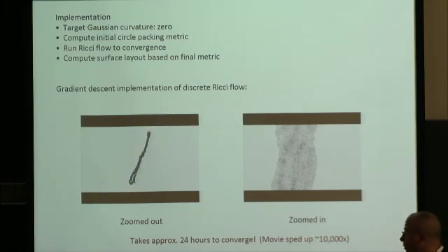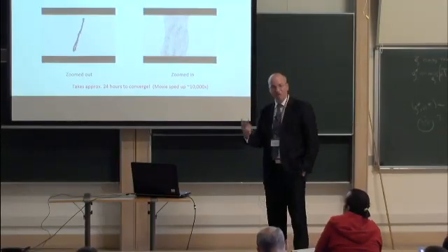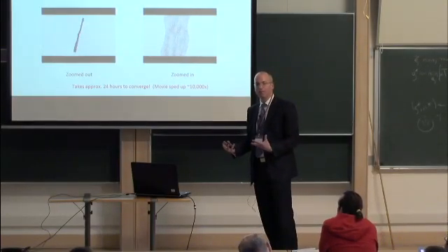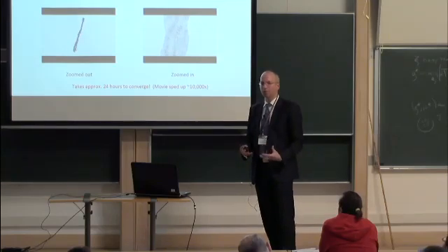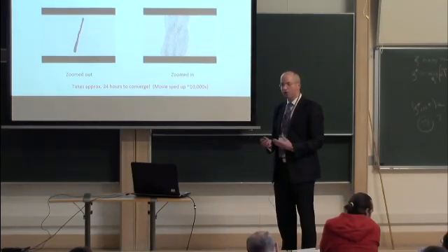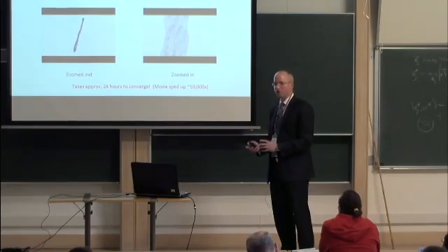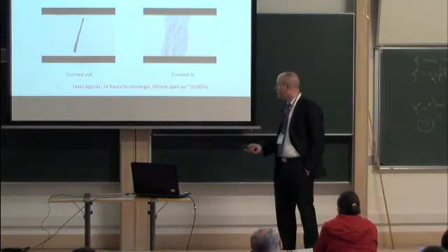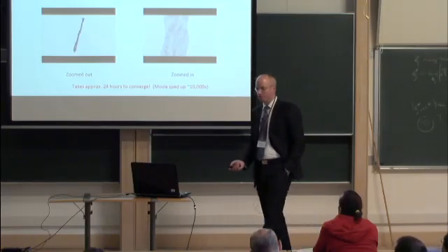So while this technique works very well, unfortunately it takes about 24 hours to converge for a single mesh, and we have 2 meshes. So this is a real problem for us because, working at a company, we want to make a very practical product that radiologists can use in the clinic. And our clinical partners told us that they were not willing to wait 2 days for a registration. In fact, I've sped this movie up by 10,000 times.